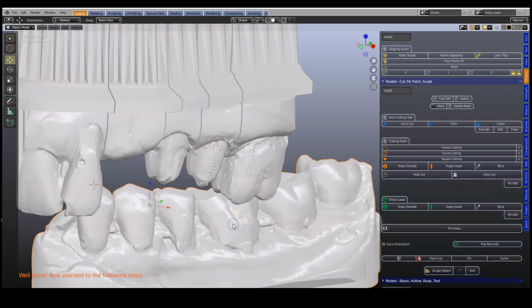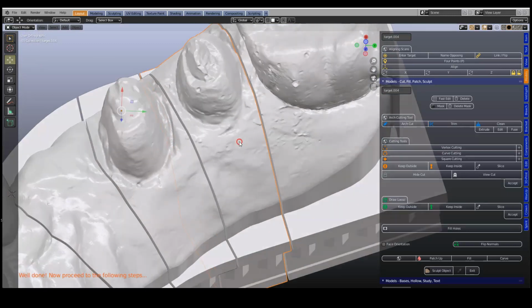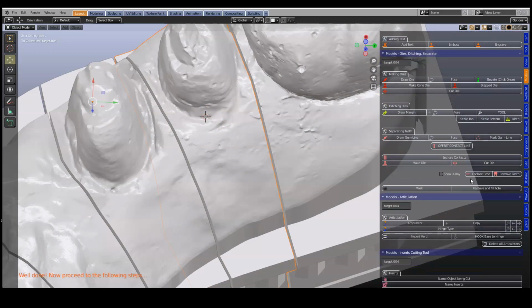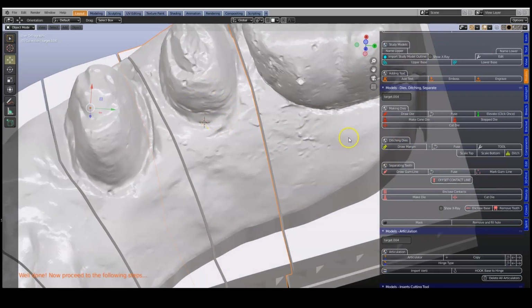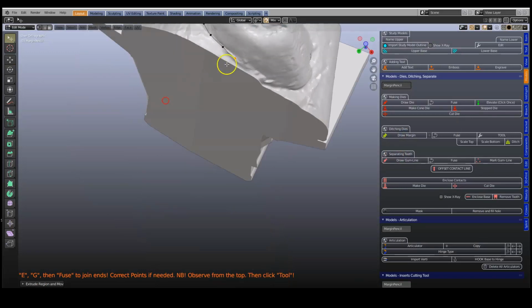I just thought I would just ditch this one as well. So I'm looking at from the top. That's my die. Shift right click. Go to the draw margin or make die. Well, actually we're not making a die. We're going to be ditching it. So we're going to be using the draw margin here. E to extrude all the way around like that.